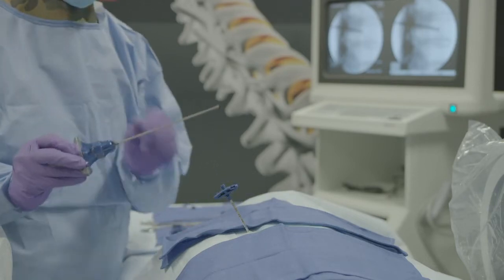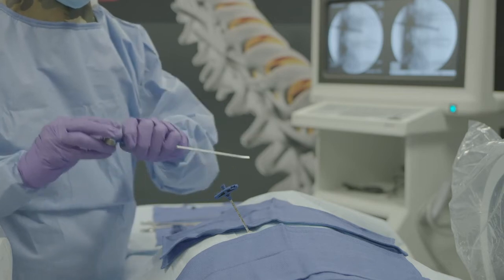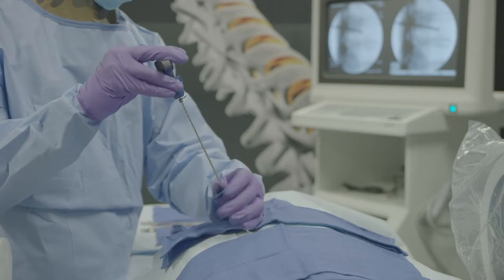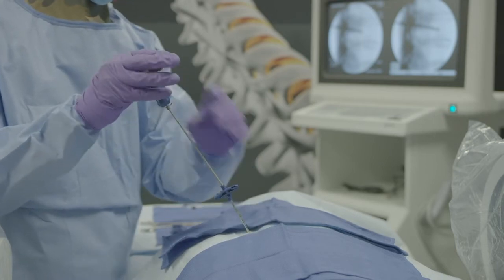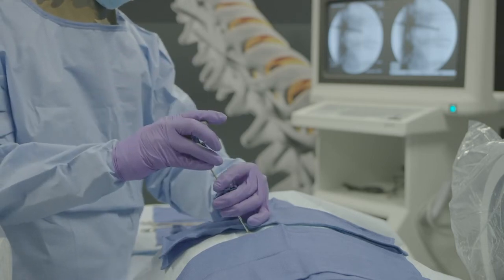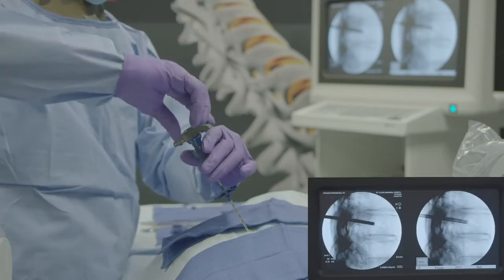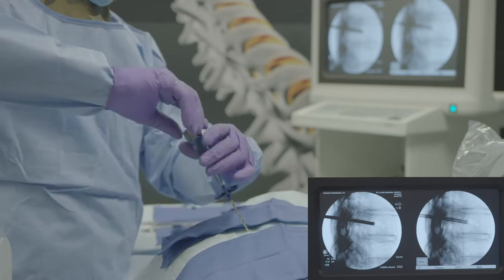Insert the power curve navigating osteotome into the working cannula, ensuring that the tip direction indicator is oriented toward midline of the patient. Advance to first laser mark on the shaft. The power curve distal tip will be flush with the distal tip of the working cannula.